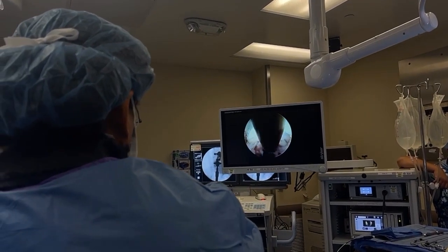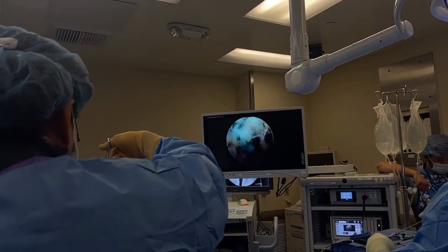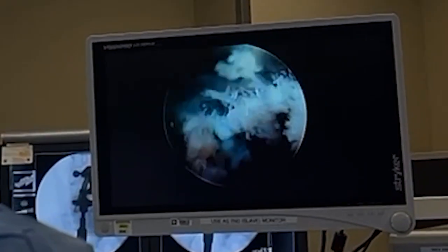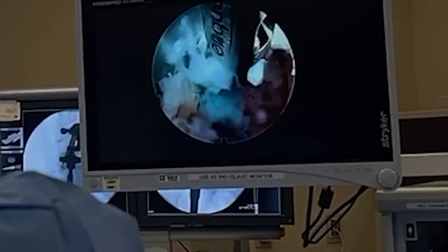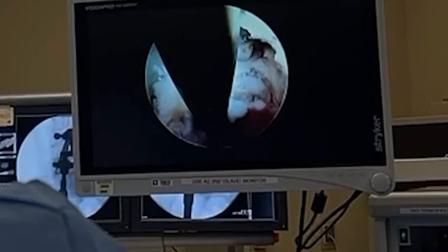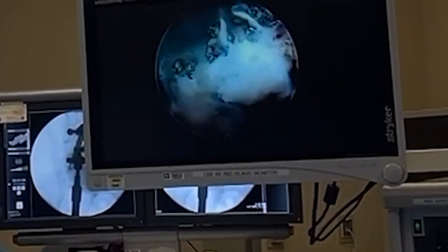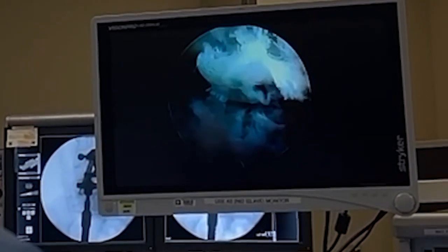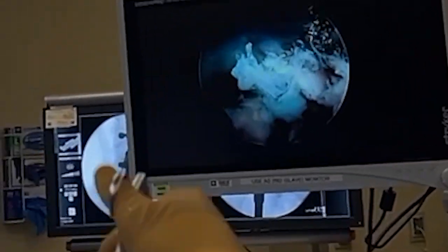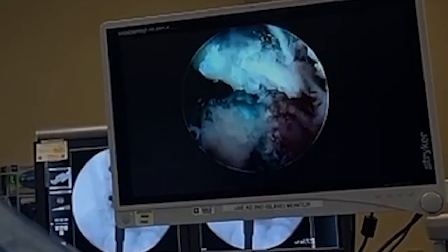This thing is like my teenage kids — it's not going to come out without a fight. Come on... it wants to come out but it's not going to just give it up without a fight. This flap is right underneath the drill tube right there. Oh, you're going to feel so much better — or I'll eat my hat. We found out that a hat is a medieval meat pie, it's not a hat that you put on your head. If you didn't do something they'd say 'I'll eat my hat.'